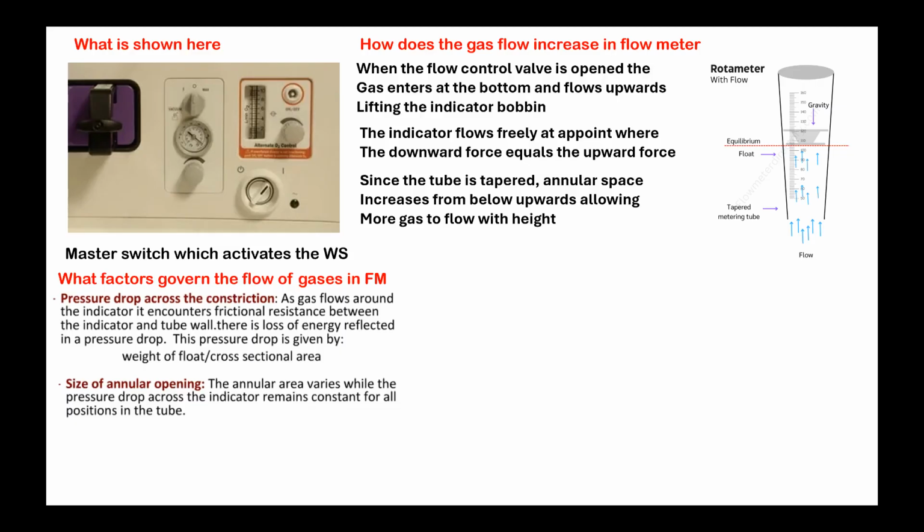What is turbulent flow? Gas molecules bombarding with each other. They make a somersault and try to hit each other. That is turbulence or agitation. So in turbulent flow, which one will be important? Viscosity? Density? Density. Laminar flow, it is viscosity. So remember LV, left ventricle. Laminar, viscosity, turbulence, density. Okay, this is another common question they ask you in the examination.